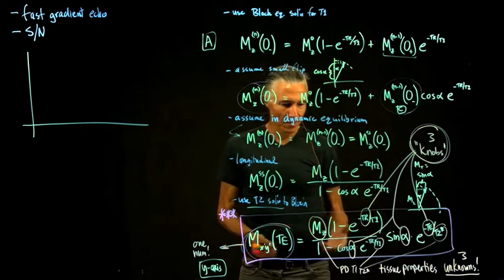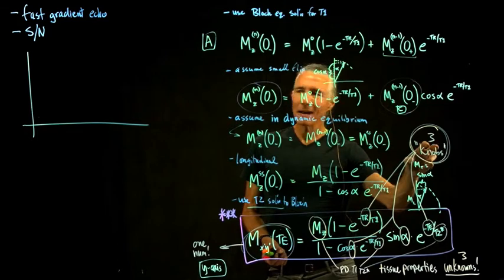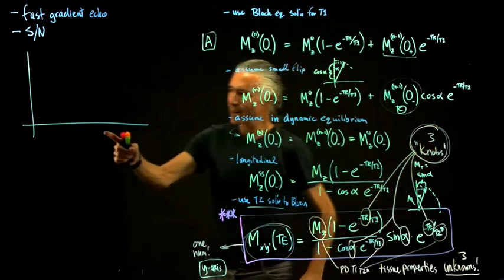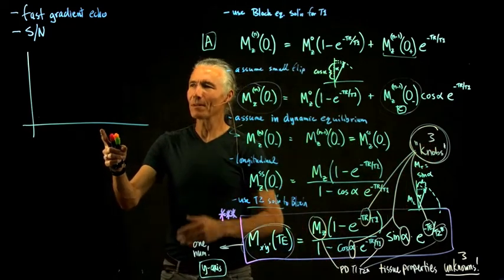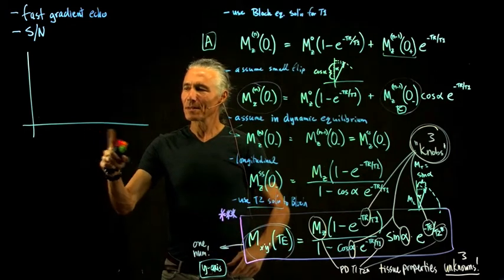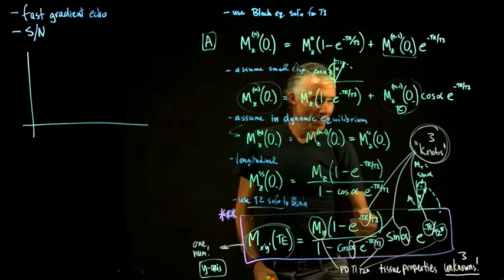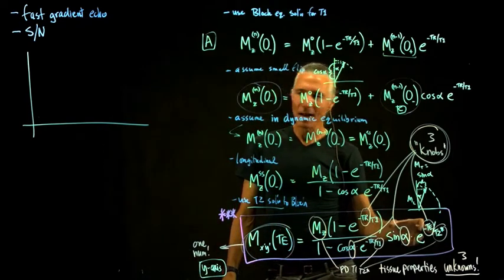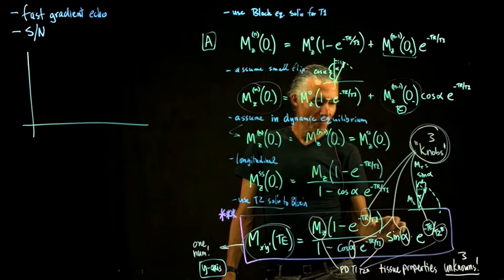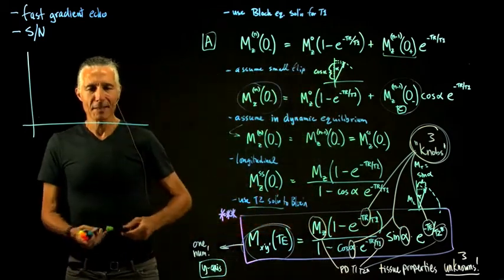or gray matter. And then now we've still got 3 knobs. But we've only got one axis here, because we're two-dimensional people that just have two-dimensional maps of things. So what we're going to do is we'll just set 2 of the knobs and just vary one of the knobs. And the knob that we're varying is the flip angle.